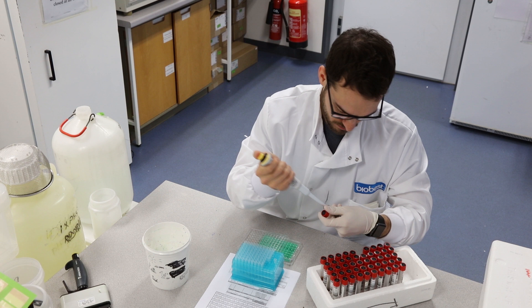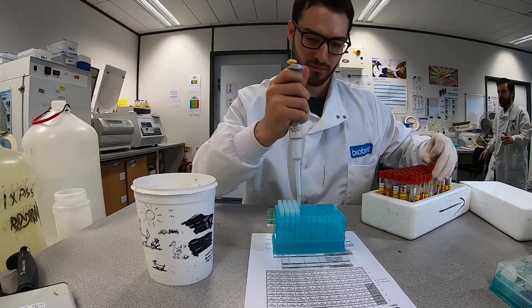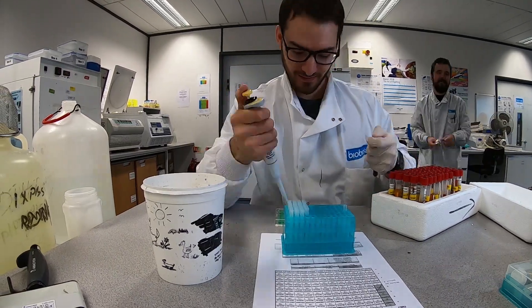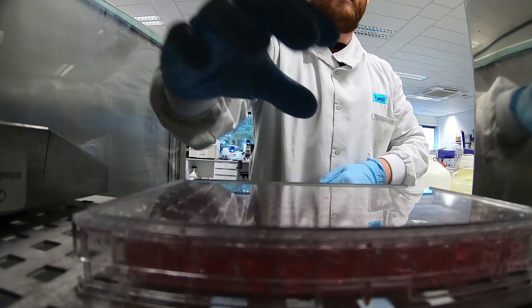We then wash that and put a HRP conjugate on. The conjugate will bind to the bovine antibodies. We then put that in the incubator for another hour. Finally, after the last wash, we add a substrate. On the end of the conjugate is a particular enzyme that will convert the substrate from a colourless liquid into colour. The higher the antibody titer, the more colour produced, and that is how we determine our antibody titer for the sample.